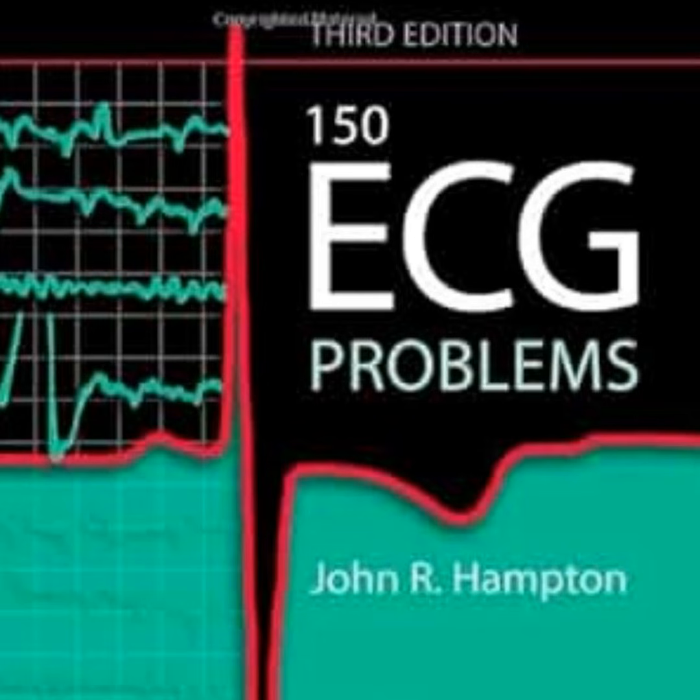Pretty much, yeah. But let's look at what happens when the conduction system actually starts to degenerate. Okay, moving up to the 2-star cases. Right. Hampton presents this intermediate 2-star case of an 80-year-old man. He's presenting with slowly progressive dyspnea, ankle edema, and a really bradycardic pulse, like 40 beats per minute. So he's symptomatic. Very. And the ECG is super complex. It shows atrial fibrillation with a slow ventricular response, a left axis deviation, and a left bundle branch block, an LBBB. That's a lot going on.